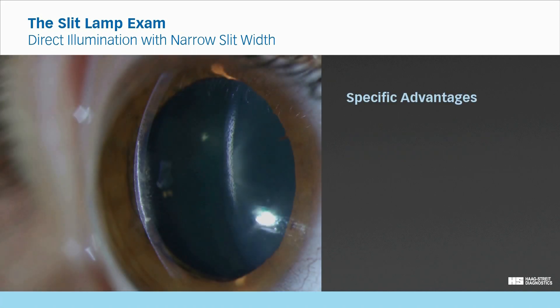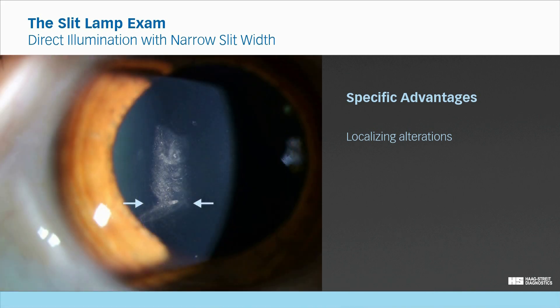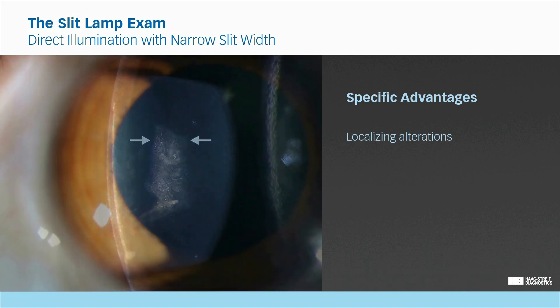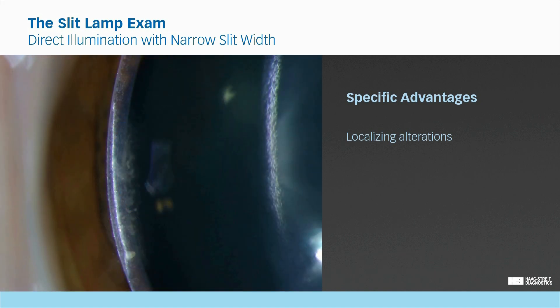The main advantage of the optical section is that it enables the localization of alterations which show increased light scattering in semi-transparent tissues. This opacity would appear in its lateral extent when viewed with a broad illumination. However, its depth appears only when narrowing the beam to a fine slit. In this case, the finding is located approximately in the anterior third of the stroma.